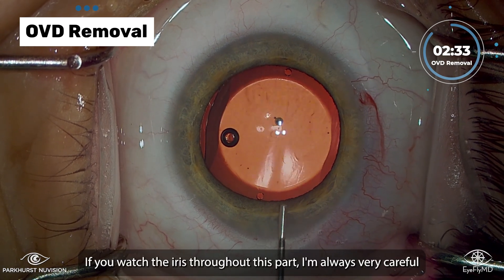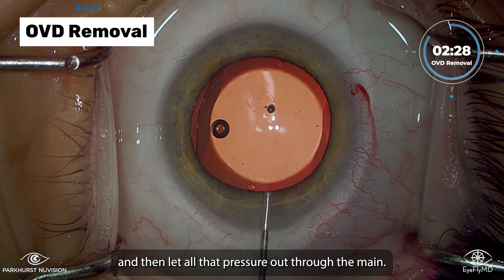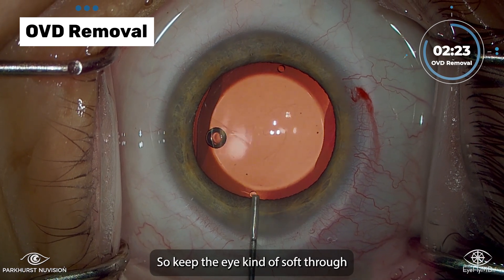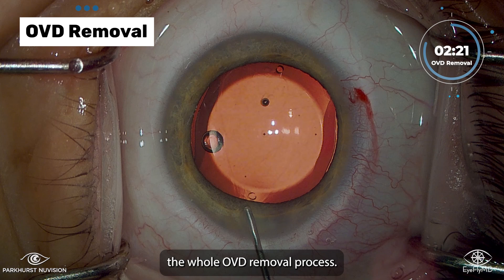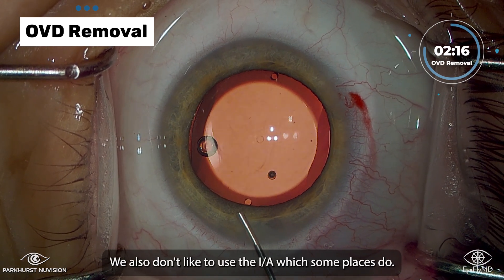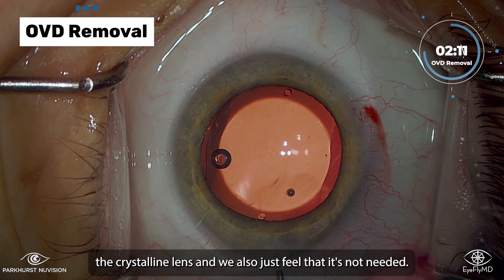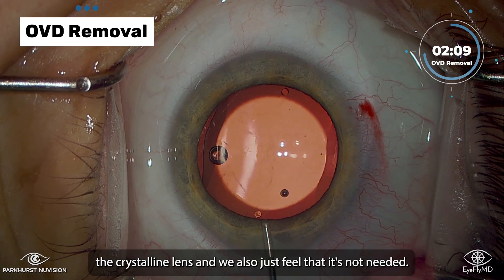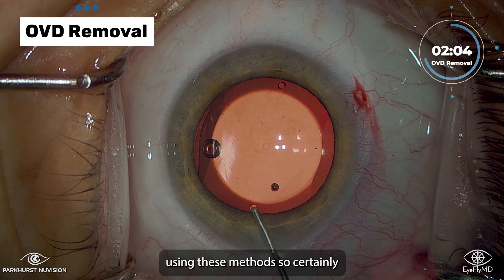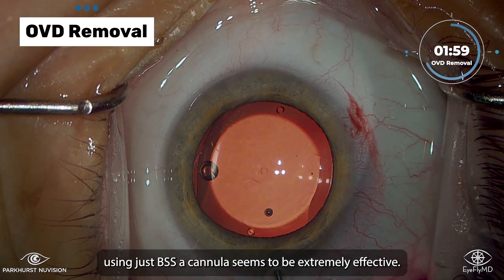If you watch the iris throughout this part, I'm always very careful not to overpressurize the eye, and then let all that pressure out through the main — keeping the eye kind of soft through the whole OVD removal process. We also don't like to use the IA, which some places do. That may create a risk of hydrating the crystalline lens, and we also just feel that it's wasteful. We very rarely have even post-op day zero IOP spikes using these methods, so using just BSS and a cannula seems to be extremely effective.